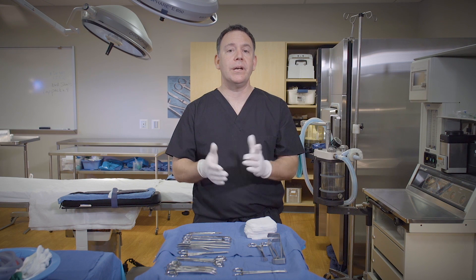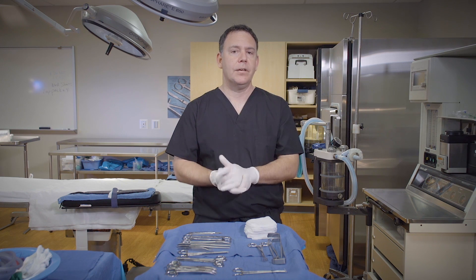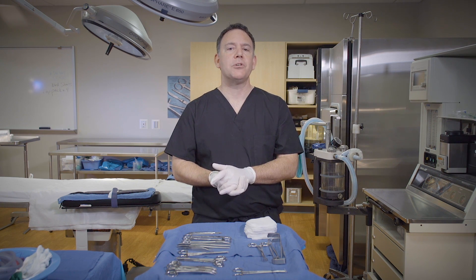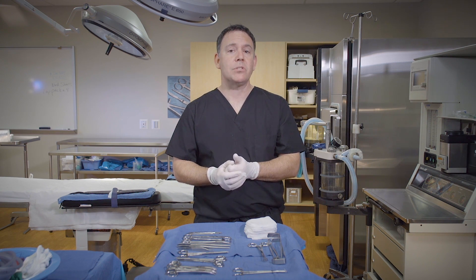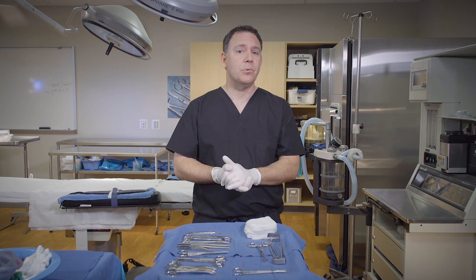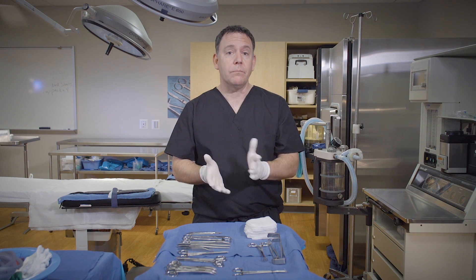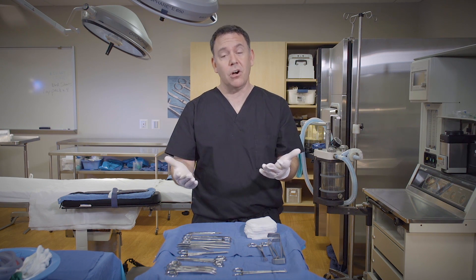At this point we have already ready to go — the patient is prepped and draped, cords are thrown off, and the surgeon is ready to start. The first thing you want to remember is to make sure the Mayo stand is at an acceptable level ergonomically and is still sterile. We can't have the Mayo stand above chest level or below waist level as those areas are contaminated. You may need your circulator to get you a step stool, or you may need anesthesia to raise the OR bed, just to make sure that we're sterile and the Mayo stand is comfortable and doesn't cause back pain.